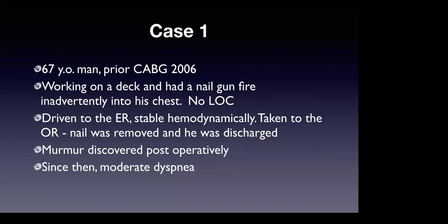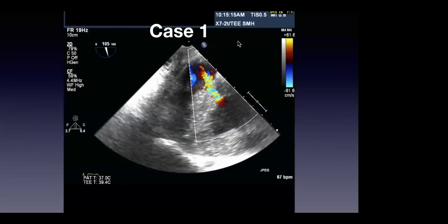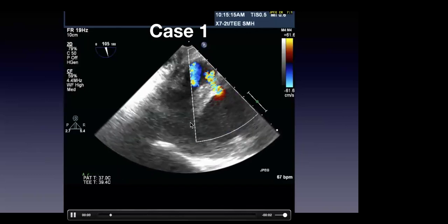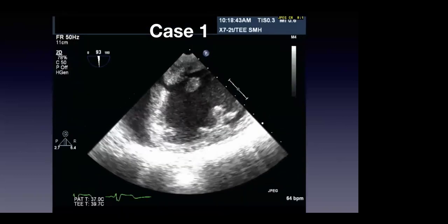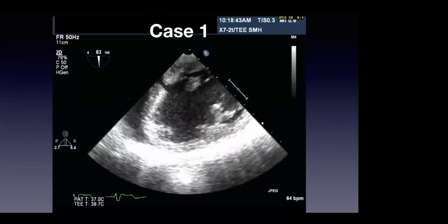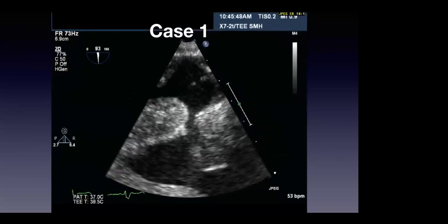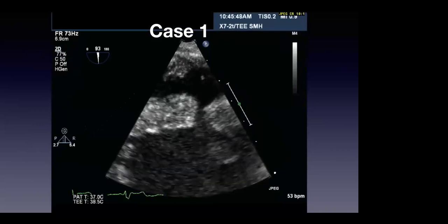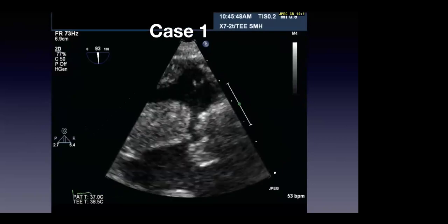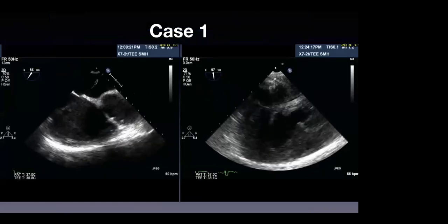So okay, here's the transesophageal echo. I'll go through this a little bit. You can see this is a transgastric view, slightly off axis. You can see the hole through the septum, in a slightly off axis short axis view. Just like the transthoracic, it's a defect in the inferior portion of the muscular septum, and it's quite clean. We didn't have 3D at that time, it would have been interesting. But you can see it's quite a large hole, and look, he has no other injuries.